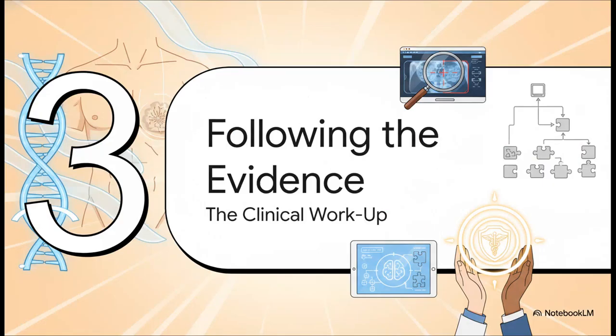So you can see how this all builds into a very specific clinical process. As soon as a radiologist spots a suspicious area of AD, and they've decided it's not just an artifact or an old fading scar, a very clear protocol kicks into gear. There's no guesswork at this point. It's a step-by-step, evidence-based pathway.